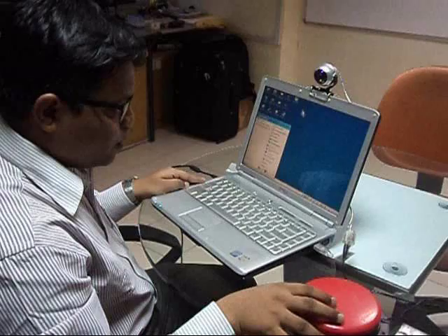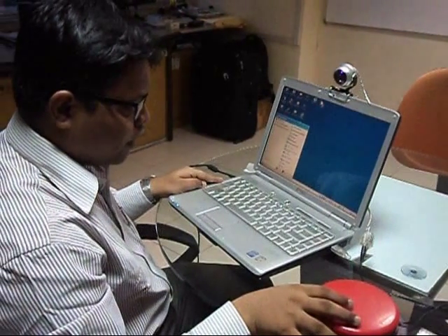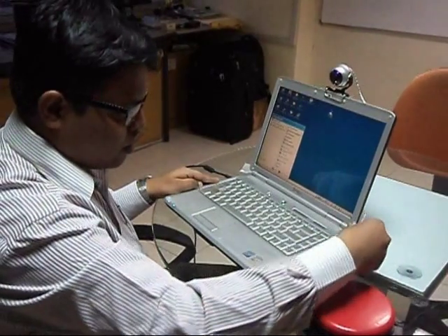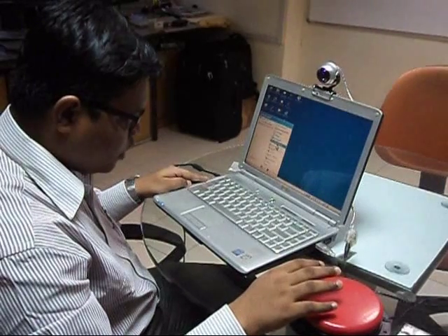For someone with little hand movements, you can connect any of your favorite switches to the Tracker Pro using the 3.5mm switch jack, and then you can use the switch to activate any of the items on the screen.